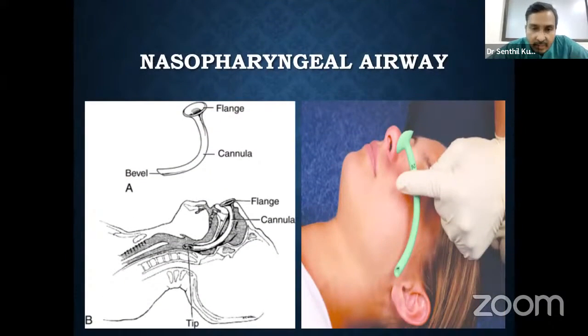Coming to the nasopharyngeal airway, the one biggest advantage compared to the oral airway is that it provides less reflex stimulus. So the tolerability of this airway in a semi-conscious patient is going to be high.